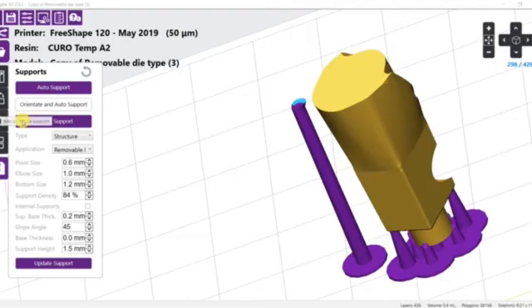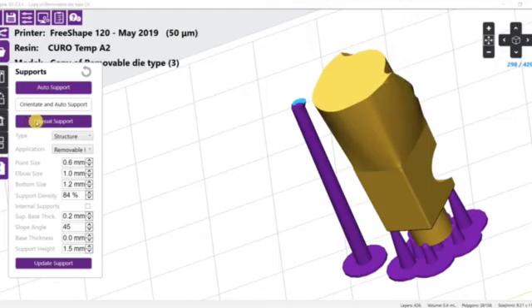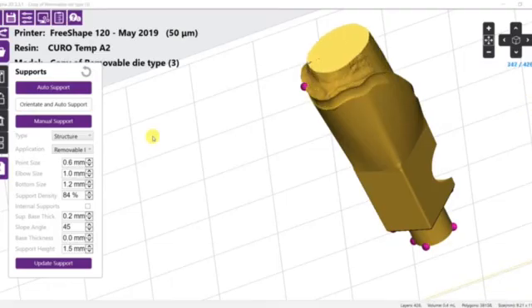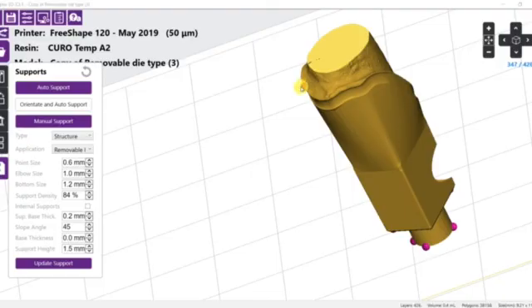Again, make sure the manual support function is active. You can tell it is active because you cannot see the supports. Instead, you see pink points shown where the supports connect the piece.